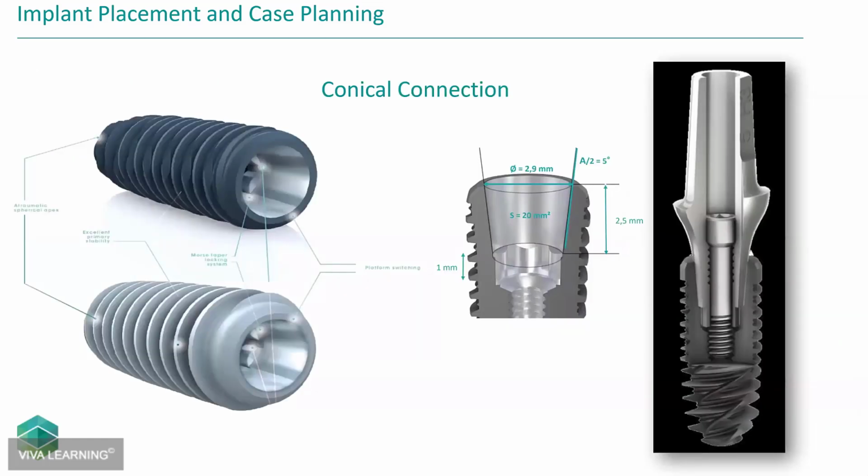But largely, the conical connection has become the new standard for implant connections, meaning we've pulled the connection inside to where the abutment screws down more internal into the diameter of the implant, which prevents micro wicking. It forms almost a cold weld type of seal. You put these abutments in, you screw them in, the connection is really low, and they are rock solid.